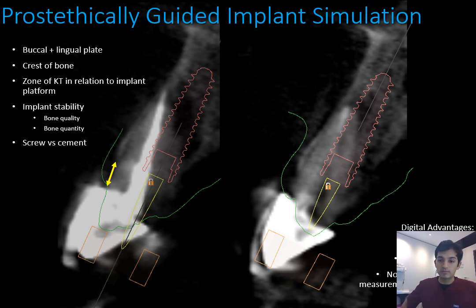It lets you know, again, if you need a soft tissue graft at the time of implant placement. In cases where you're going to do the implant in a flapless manner, do you need to take into consideration a soft tissue graft at time of placement? Should you raise a flap to allow for a second stage procedure where you want to roll the tissues, or is it thick enough to begin with? So having this additional information, the ability to view the soft tissue profile in relation to the underlying bone, that's a huge plus in terms of planning.